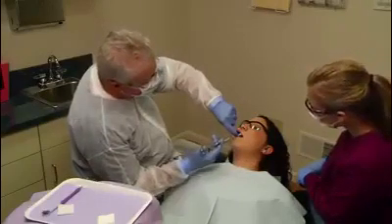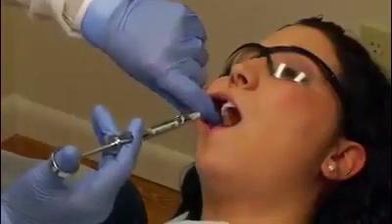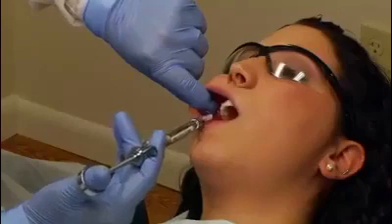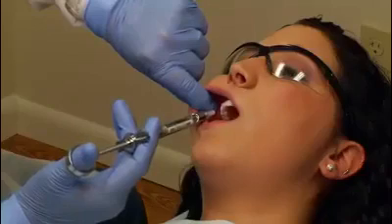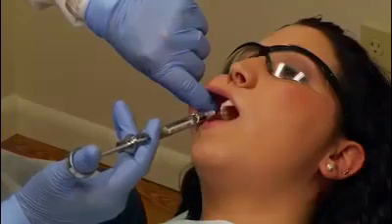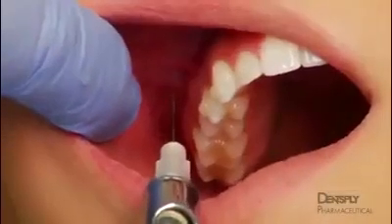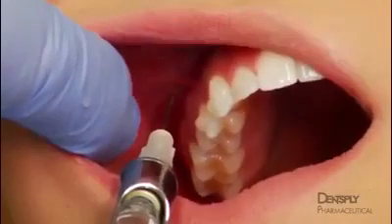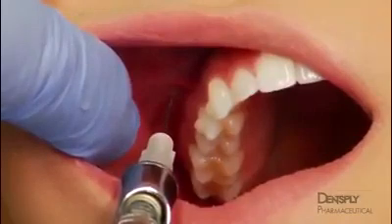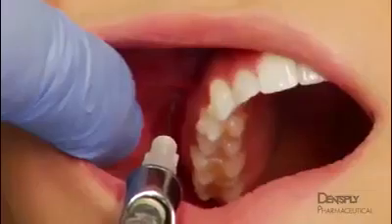Using a 27-gauge short needle, orient the syringe parallel to the long axis of the tooth with the large window facing the operator. Insert the needle at the height of the mucobuccal fold at the apex of the maxillary second premolar, approximately 1/4 of the depth of the short needle, about 5 millimeters, or until the bevel is slightly superior to the apex of the tooth. Aspirate within 2 planes. Slowly deposit 0.9 to 1.2 milliliters of solution, about 1/2 to 2/3 of cartridge, over 60 to 90 seconds. Other nerve blocks.